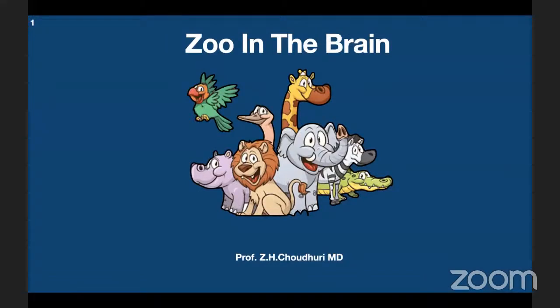Okay. So today my presentation will be a little bit different, and it's funny. The interpretation of any radiological image needs a clear understanding of the semiology. In the following 25 to 30 minutes, I'll be discussing a number of animal-inspired radiological signs. These signs are easily recognizable and highly memorable.